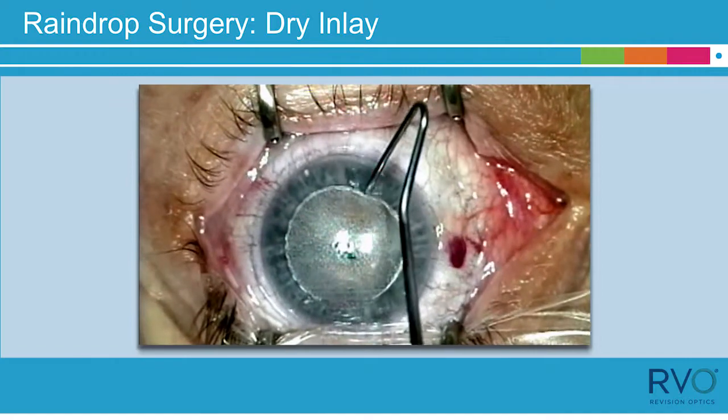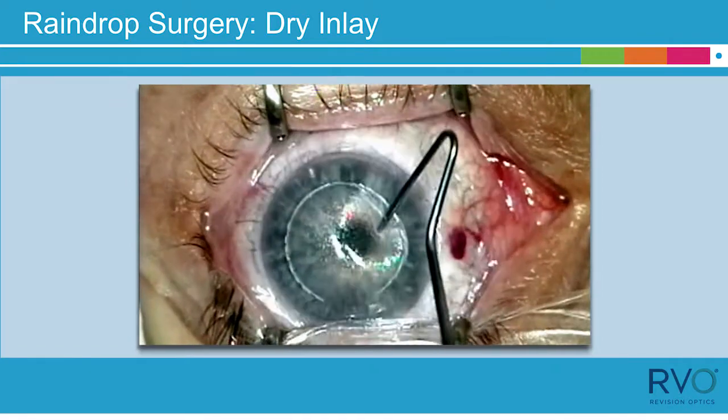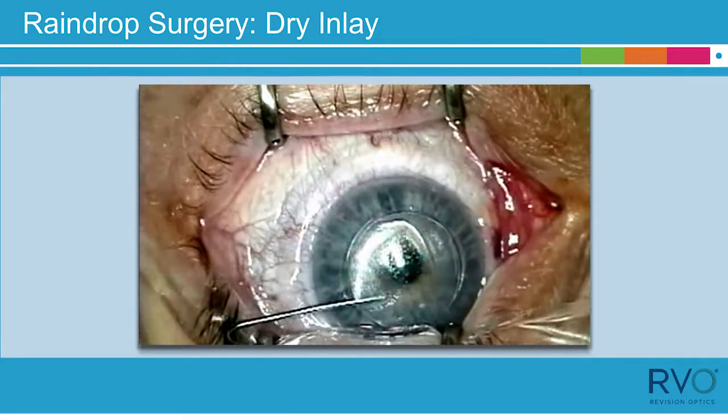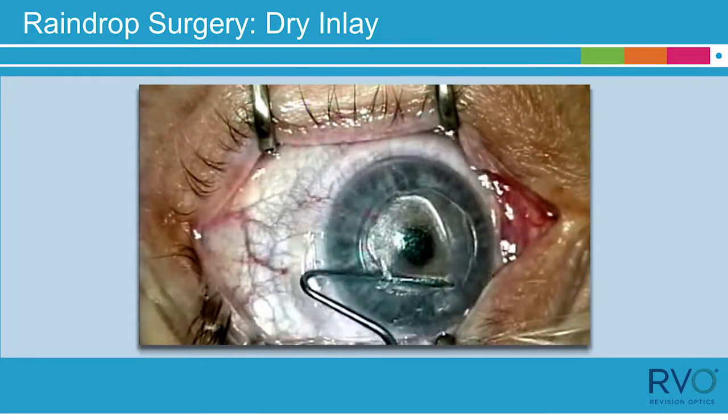Using an instrument such as a SIBL spatula to open the edges of the flap, break up tags of the interface, then lift the flap as shown. Folding the flap is not recommended.